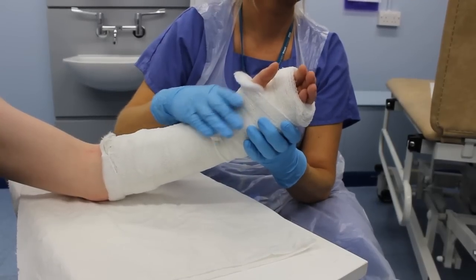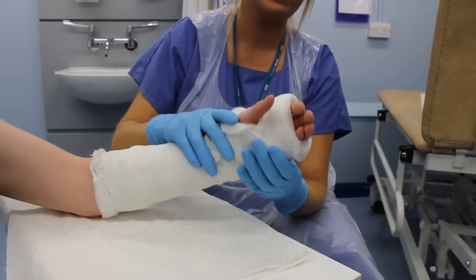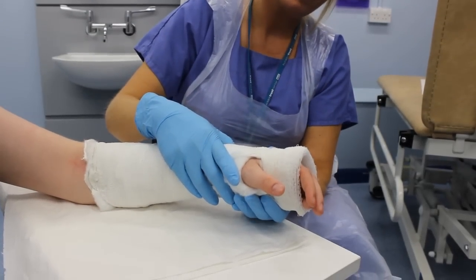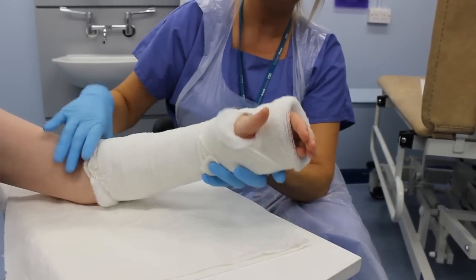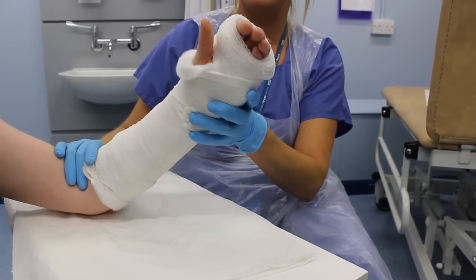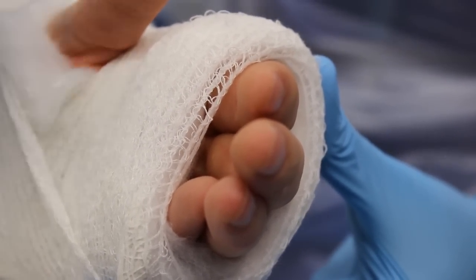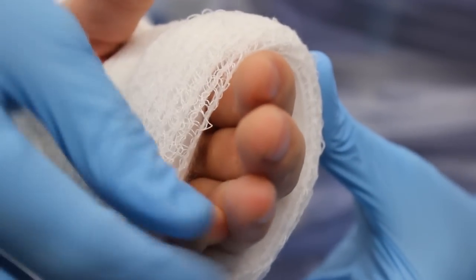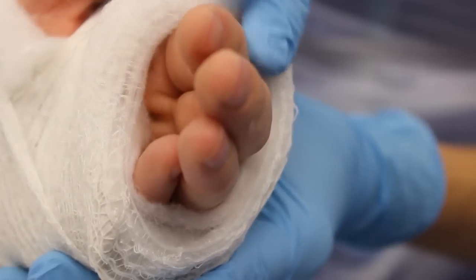Are the fingers, toes, or other joints exposed — swollen at all? If they are swollen and sensation is altered, seek medical advice. This cast may need easing or splitting. The fingers in this cast are squashed and may become swollen — movement is restricted. This needs trimming by an orthopedic nurse.